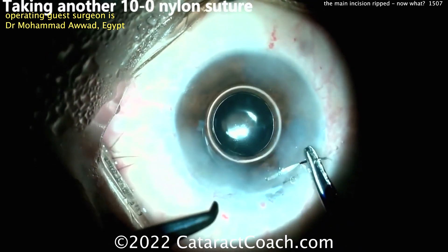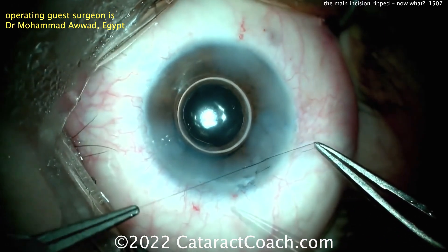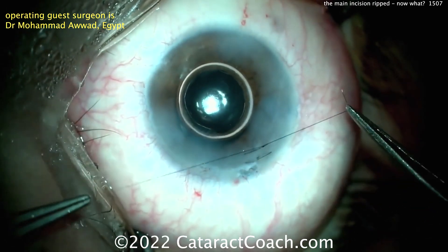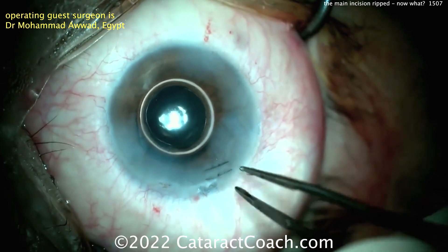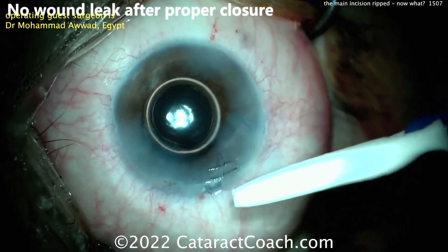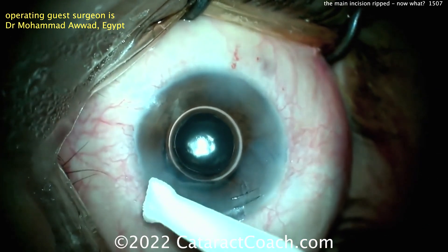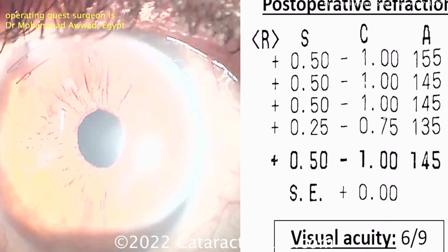Here another suture going in. These sutures you may have to leave in for a prolonged period of time — don't think you're going to remove them after a week. You may have to leave these in the eye for a month, two months, or even longer. Just take it day by day and see how the patient does. Very nice suturing technique here; it looks pretty astigmatically neutral, and that's really helping to repair that. Burying the knots is an important consideration. I'm happy to say this patient had a really nice outcome in terms of refractive state as well as healing. Just be patient — avascular tissue like the cornea takes a lot longer to heal than vascular tissue. Give those sutures months to really help heal up. Some antibiotics here at the end, sub-conj. Here's the refractive result — beautiful, going from a white cataract to 20/30 visual acuity. That is great. Thanks for sending the video in.